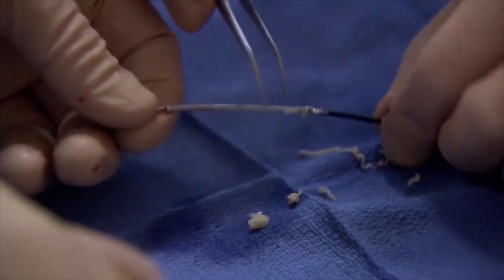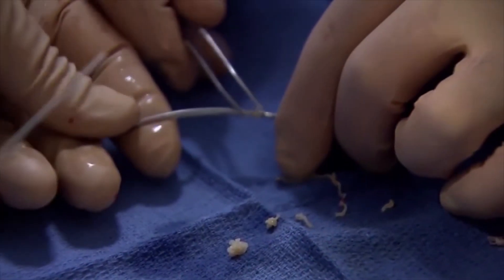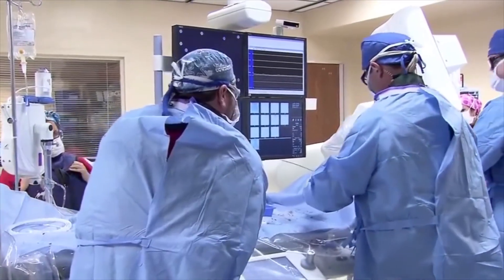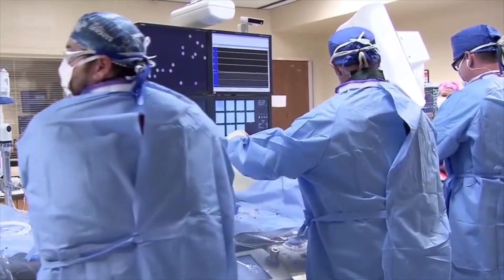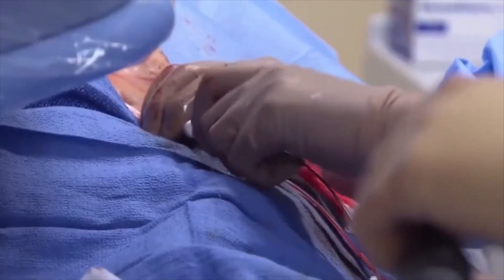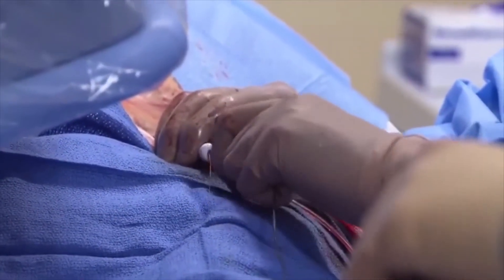We've shaved the inside of that vessel down and that's what's coming out right now. We've made a few passes through that distal lesion and we're going to go ahead and make a few more — we've still got a little bit of progress we can make there. Then I'm hoping we're going to be done. We'll obviously do some completion pictures and hopefully everything will look good.